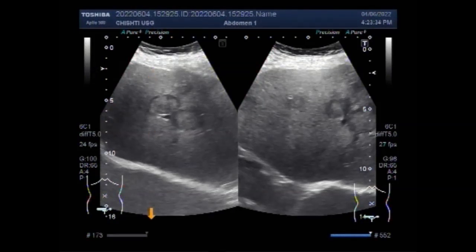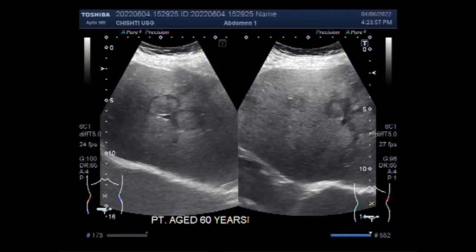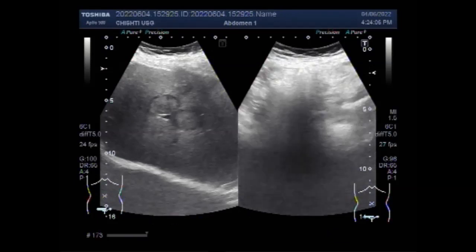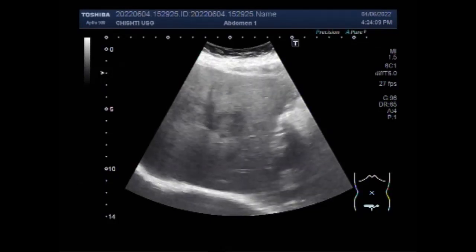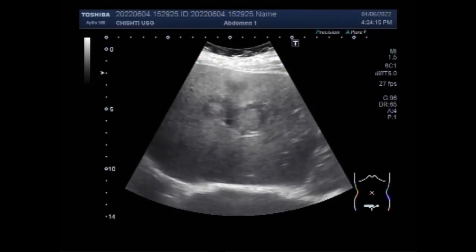This ultrasound video shows multiple hepatic masses in a 60-year-old male patient. The ultrasound imaging features of liver metastasis from the gastrointestinal tract are as follows: bull's eye appearance, as you can see in this picture, multiple masses, irregular tumor borders, arterial rim-like enhancement, and hypo-enhancement of the late vascular phase. The metastases are seen throughout the entire hepatic parenchyma in both lobes of the liver.